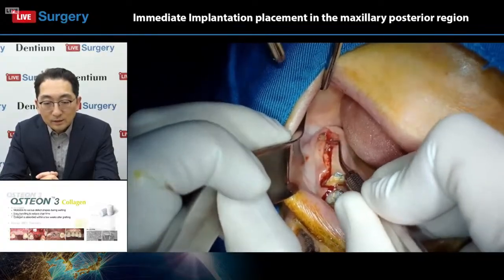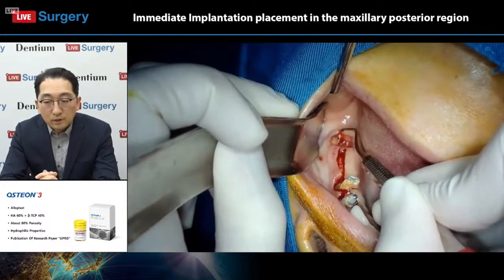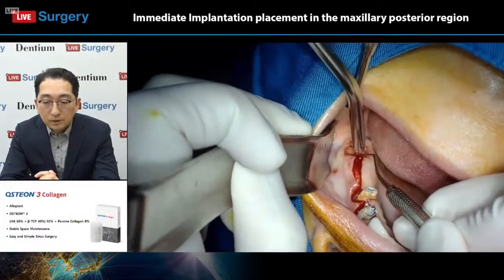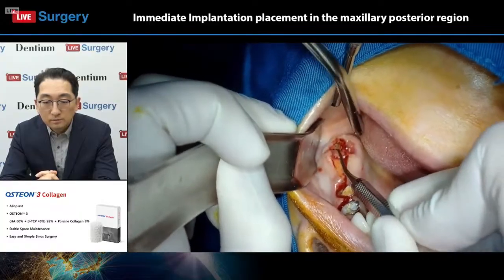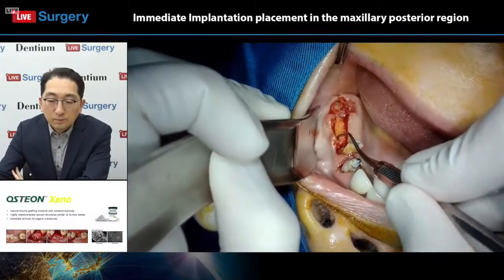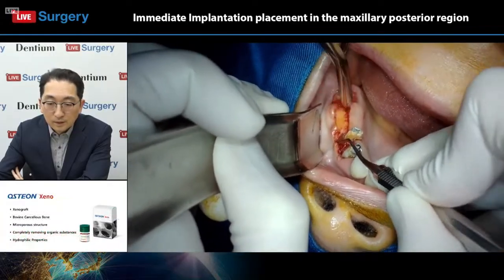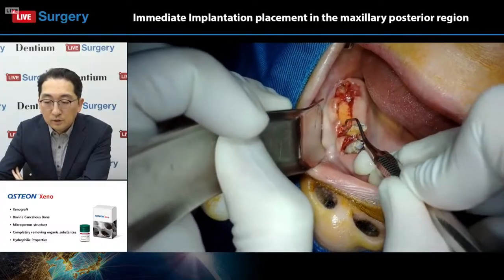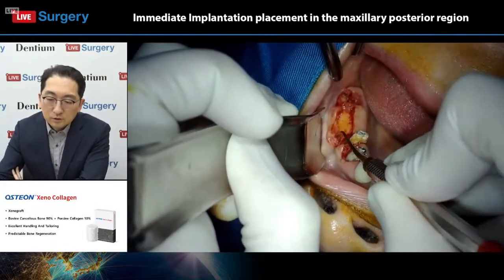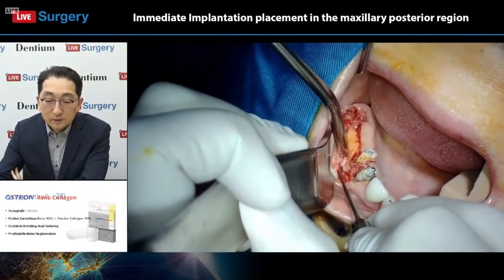No matter how cleanly we make the incision using blade, if the underlying bone is irregular, the periosteum often cannot be completely incised with the blade alone. In such cases, if you try to raise the flap using only a periosteal elevator with force, it ends up causing significant trauma to the flap. The flap does not open well, the surgeon struggles, and the patients may experience more postoperative pain and swelling.